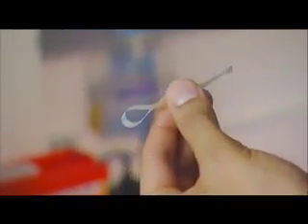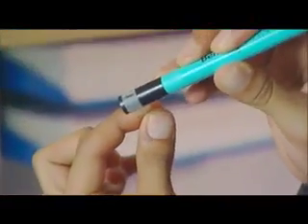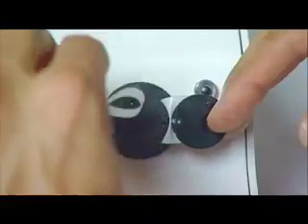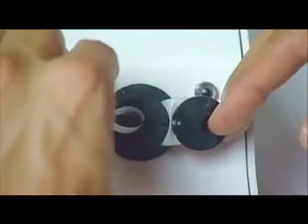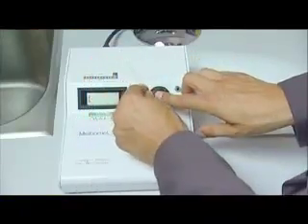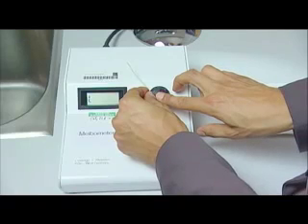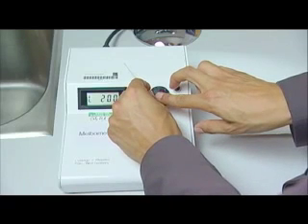After application, the tape is air-dried for three minutes to allow tears to evaporate if necessary. The optical density of each tape is read in the meibometer by placing the tape loop into the housing, closing the light-tight cap, and rotating the tape loop across the reading head.